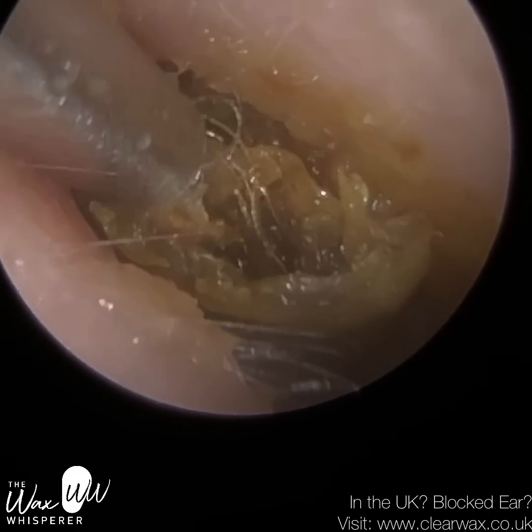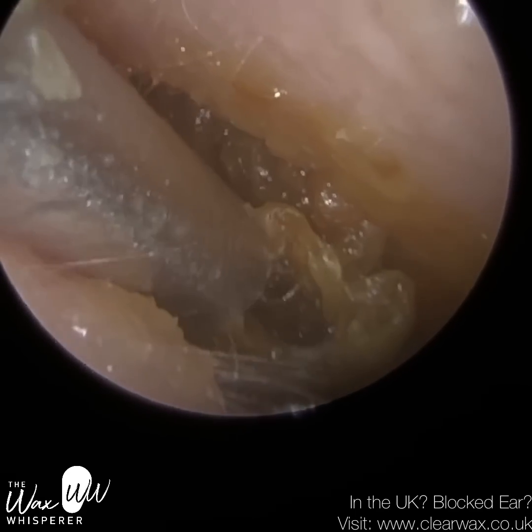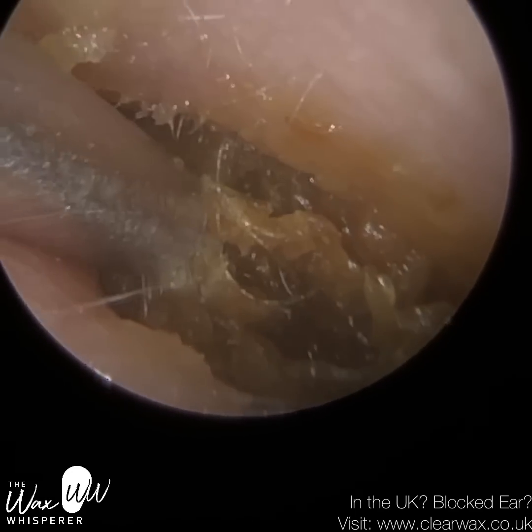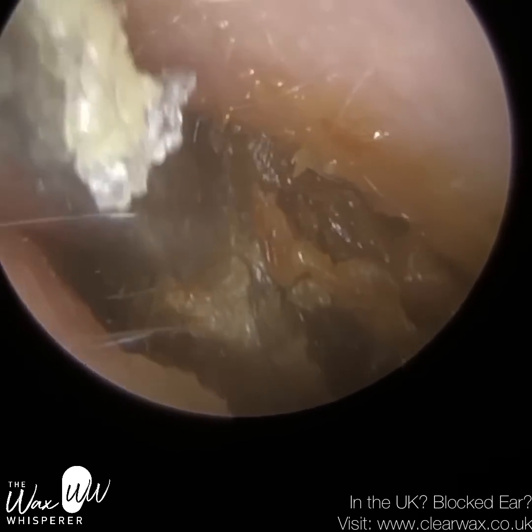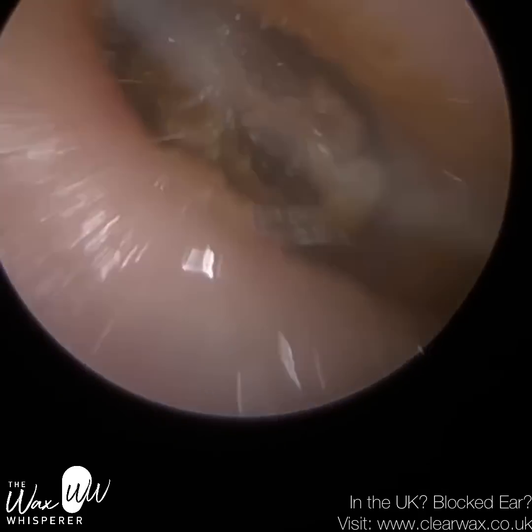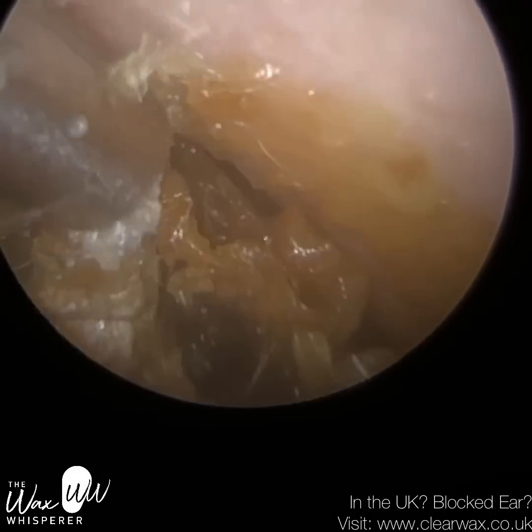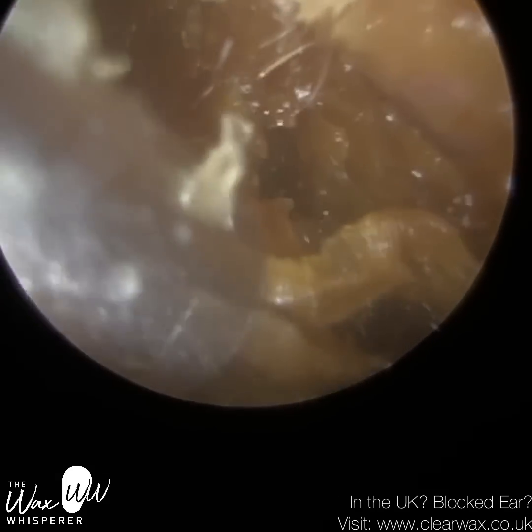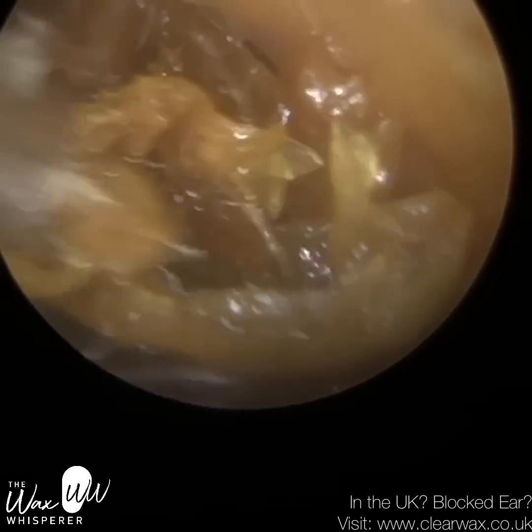They've got a narrow ear canal. One of the reasons the patient wanted to lay horizontal, with the head slightly up, is because in the past they've had earwax removed and felt really dizzy. They suffered from the caloric effect, and they just felt safer laying down on this occasion, just in case they felt a bit of vertigo. I'll explain the caloric effect in a moment.